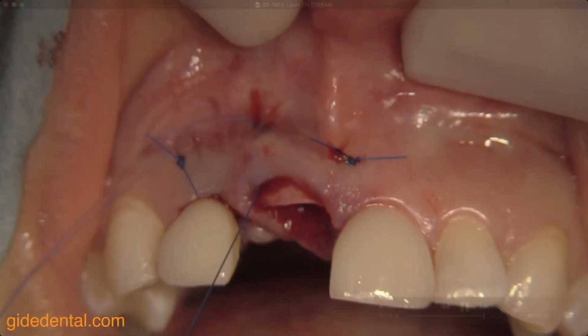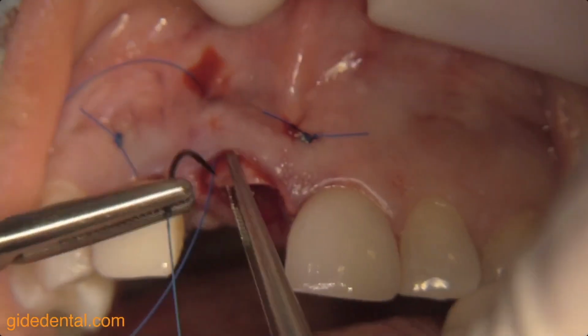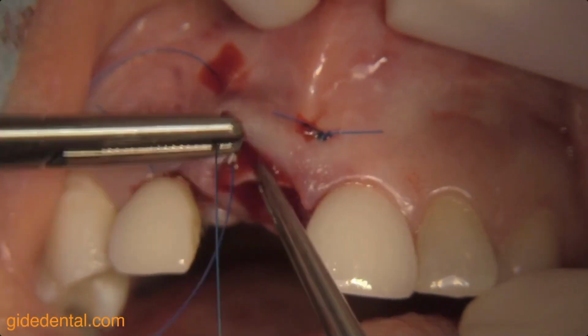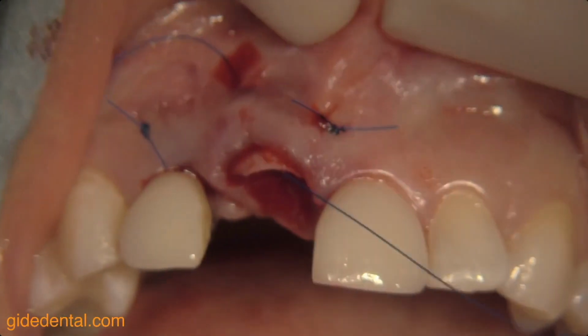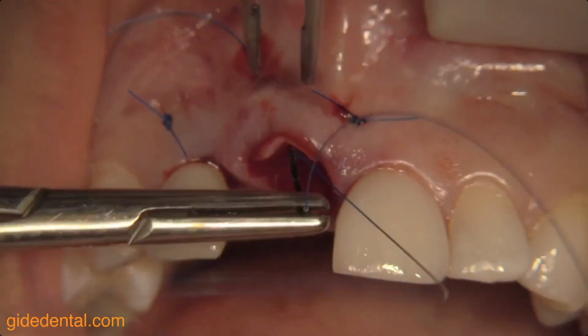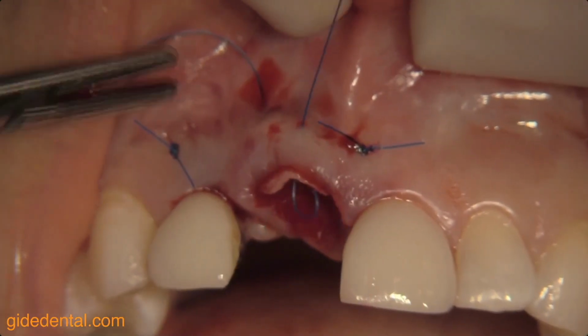So let's see what this suture will do. So I'm having now a nice horizontal spreading of the flap. And with this one, I'm attaching and stabilizing the connective tissue towards the buccal flap. So that's a nice positioning. You see I went through the connective tissue. Yeah, that's looking good.